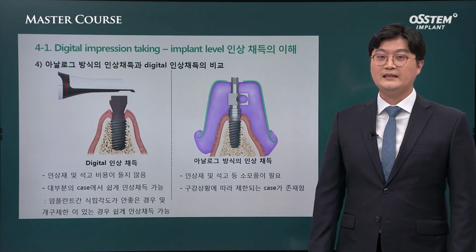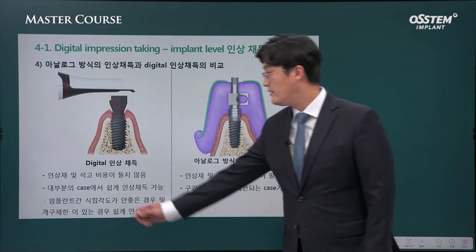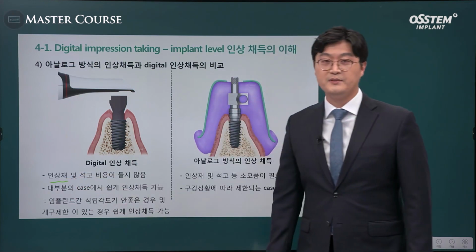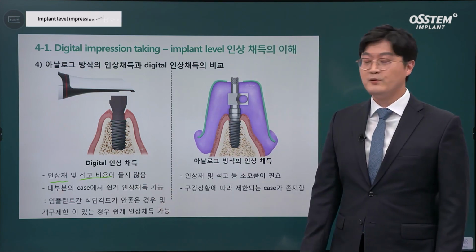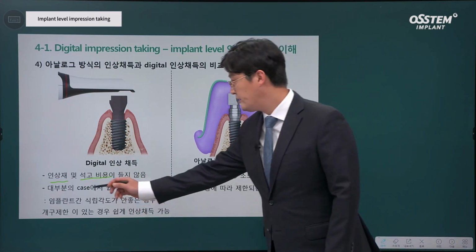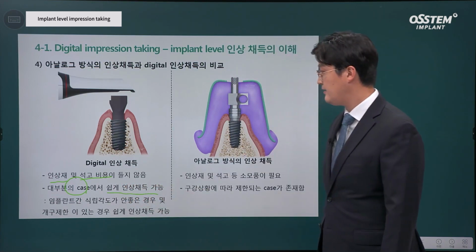Compared to the analog method, digital has many advantages. First, hygiene. Impression materials are not needed. You can keep your clinic clean. Second, there's no need to pour stone. In most cases, really in most cases, impression taking can be done very easily.